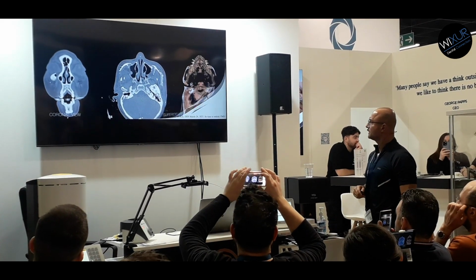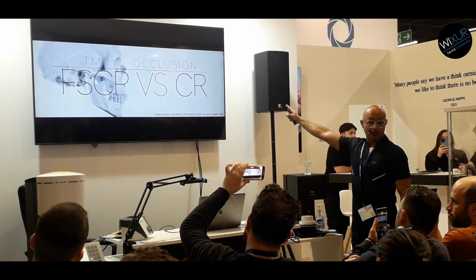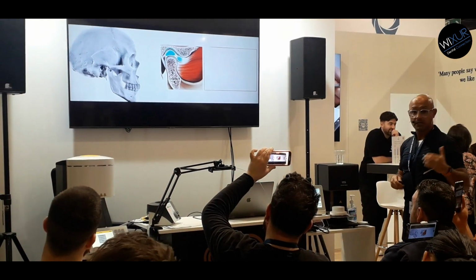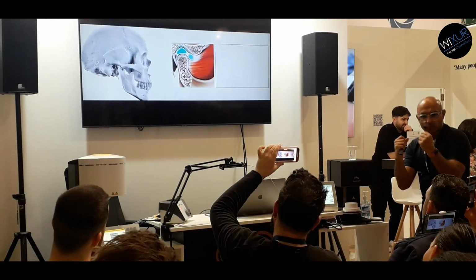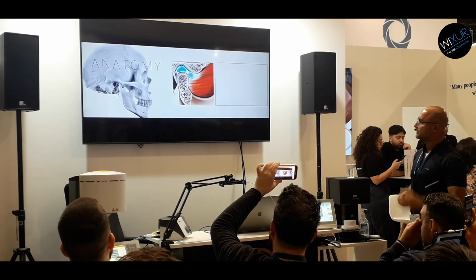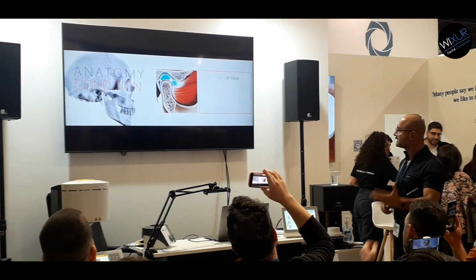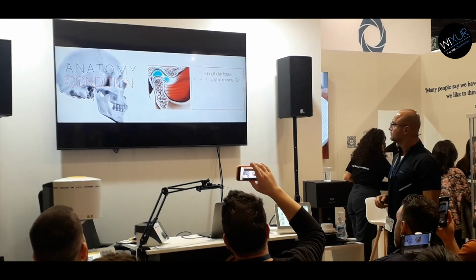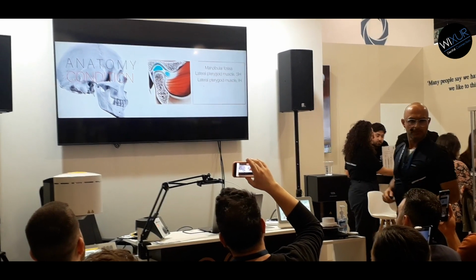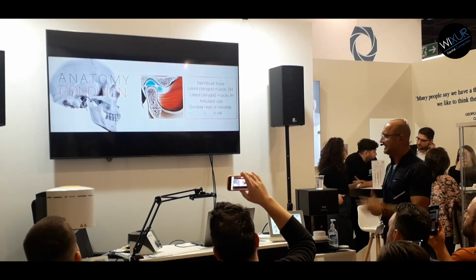So some movies, not for today. And now the concept changed. We need CR and also a fully seated condyle position. You have to determine it. Now we know why the dentist was not able to find the right place of surgery at the first moment. So that way for us as technicians it is also important to understand anatomy, condition of the muscles and bones. So the occlusion is not the teeth, this is the occlusion. So we have to know this before we start the design of anything, any case.